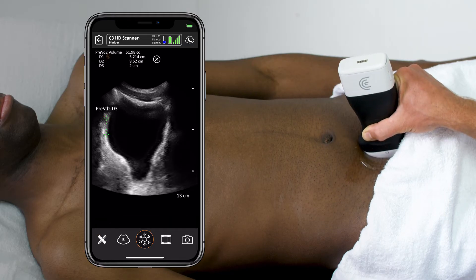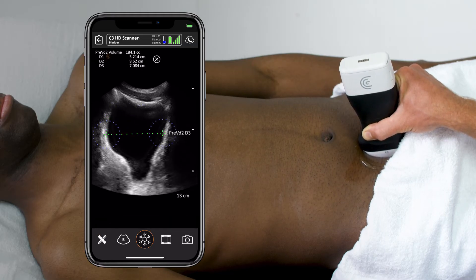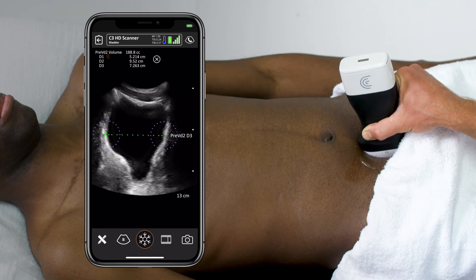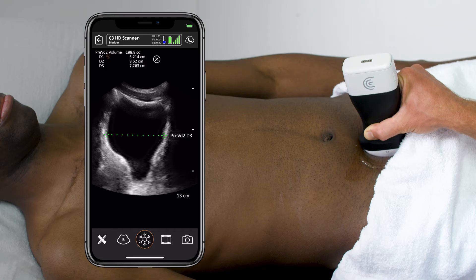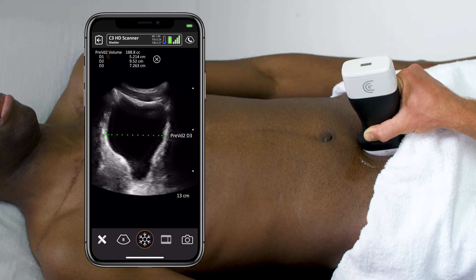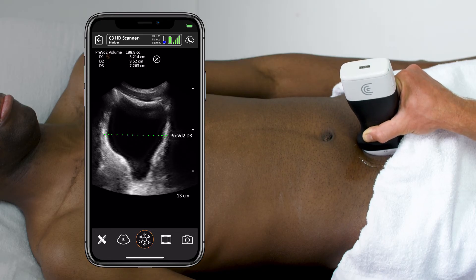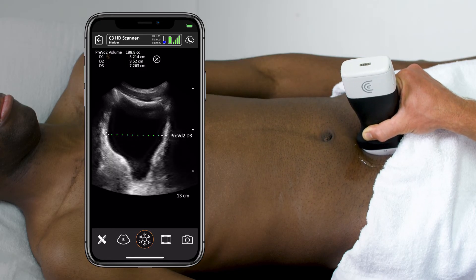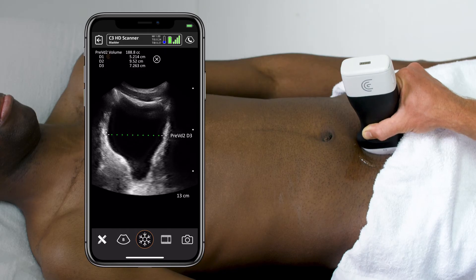I click back on and go back into pre-void. I place my third caliper, and at the top I have the automated calculated volume of 189 cc's. I can click the camera to save the image to record as needed.